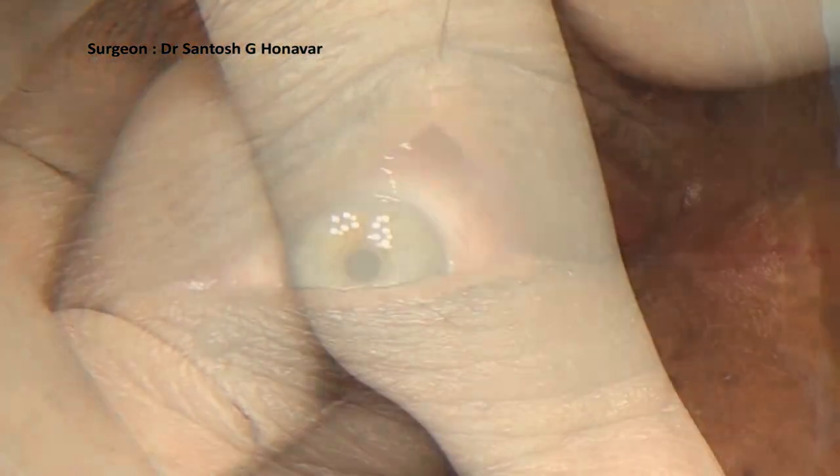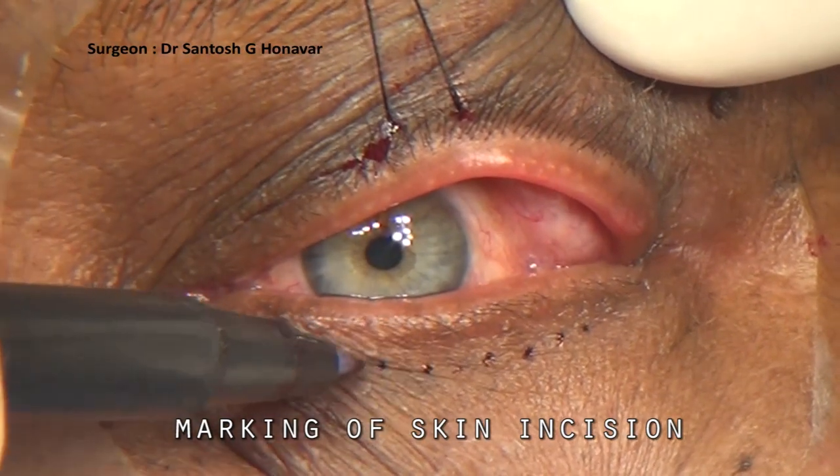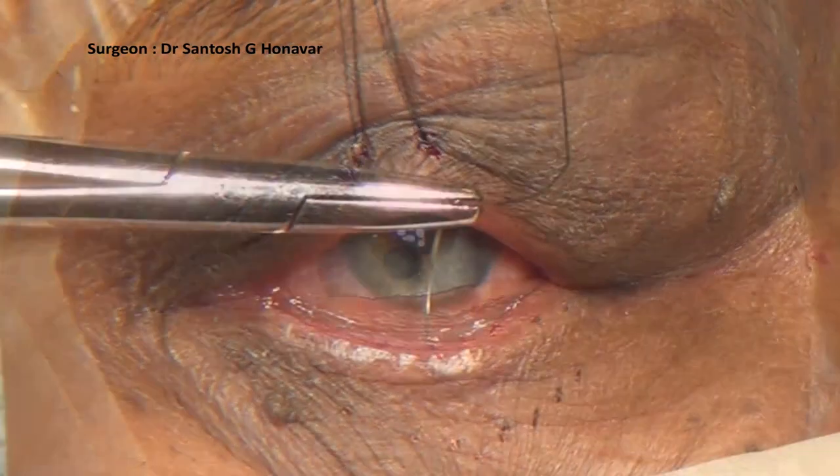The incision marking is done 4 mm below the lash line at the lower edge of the tarsus. Three traction sutures are passed with 4-0 silk sutures.